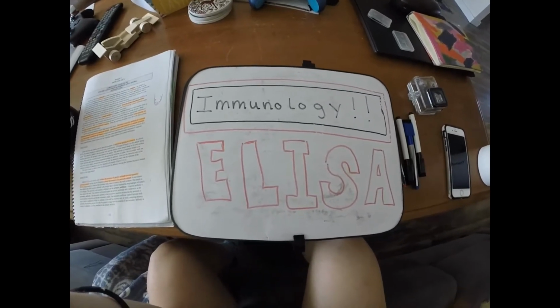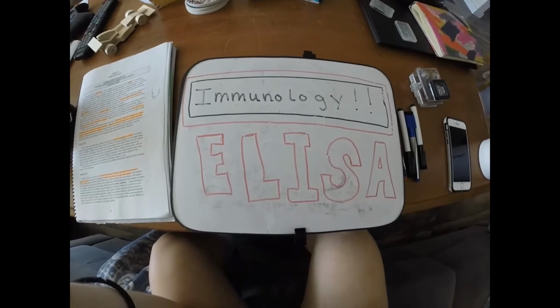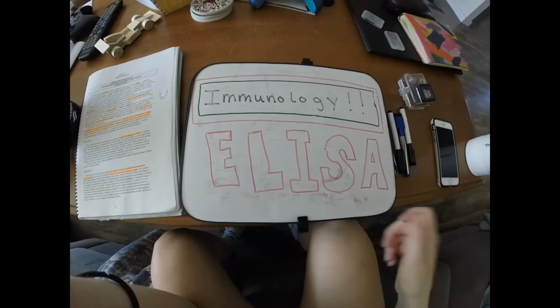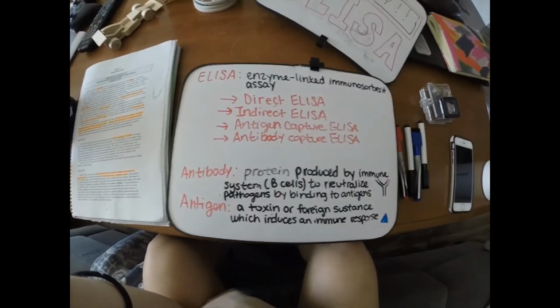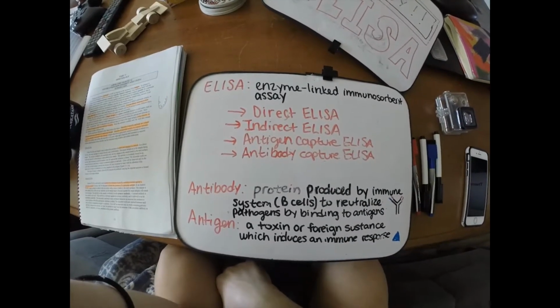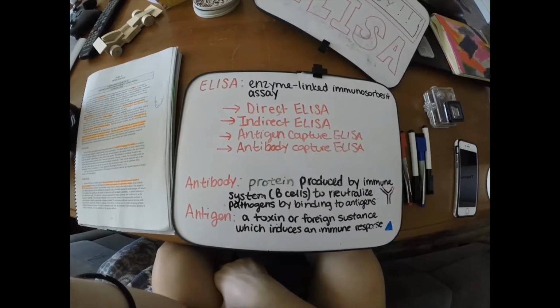Today we'll be talking about exercise 11, which is our immunology exercise. Specifically, we'll be talking about ELISA. So what does ELISA stand for? ELISA stands for Enzyme-Linked Immunosorbent Assay. And there are several different types that we're going to talk about, or that your pre-reading talks about.